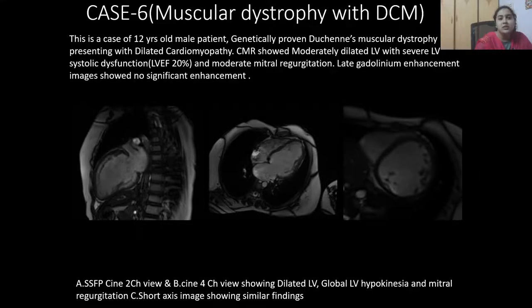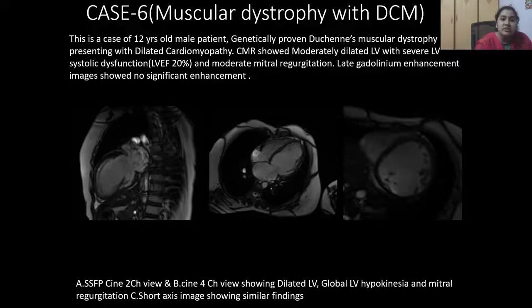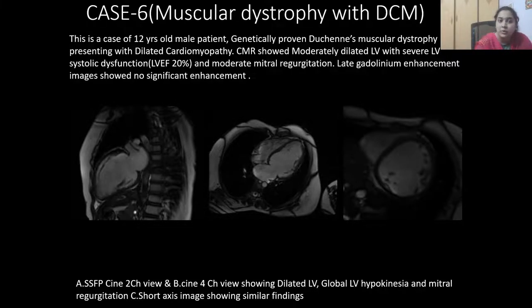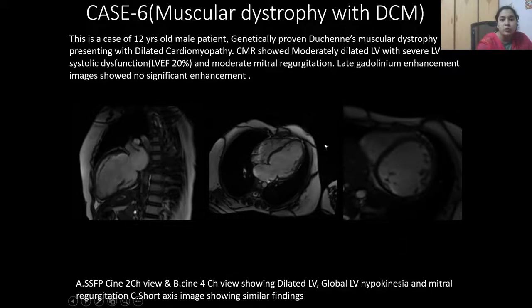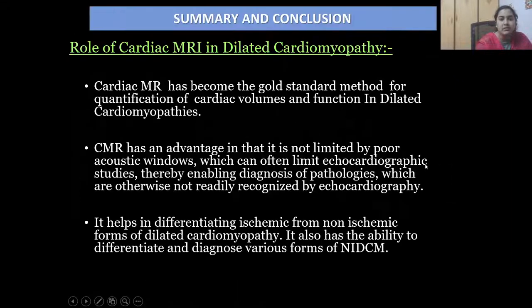Case 6 — Duchenne's muscular dystrophy: a 12-year-old male with genetically proven Duchenne's muscular dystrophy presented with DCM. Cardiac MRI showed moderately dilated left ventricle with severe LV systolic dysfunction and ejection fraction of approximately 20%, and moderate mitral regurgitation. Late gadolinium enhancement images showed no significant enhancement. Two-chamber and four-chamber views show dilated left ventricle, global LV hypokinesia, and mitral regurgitation. Short-axis imaging showed the same findings.